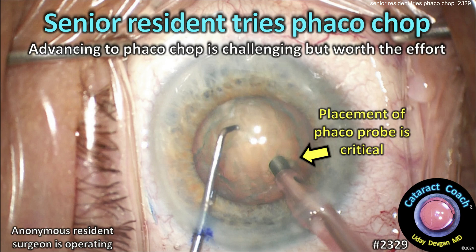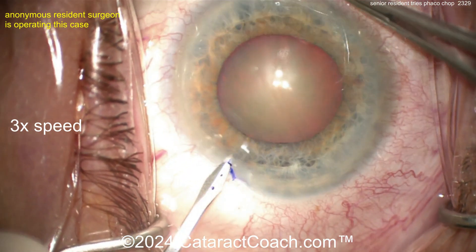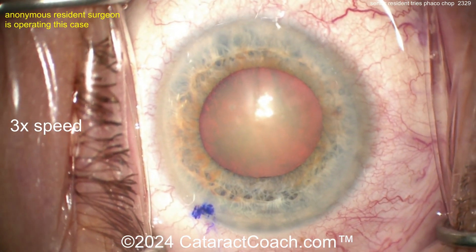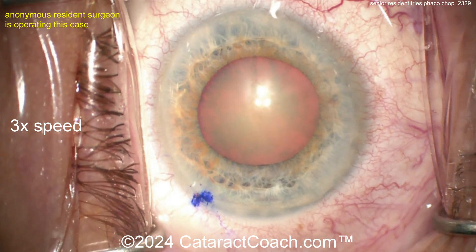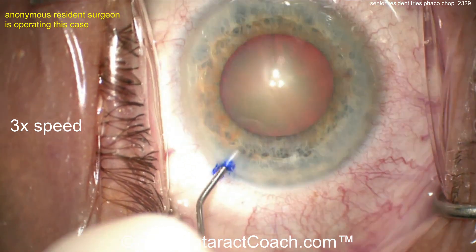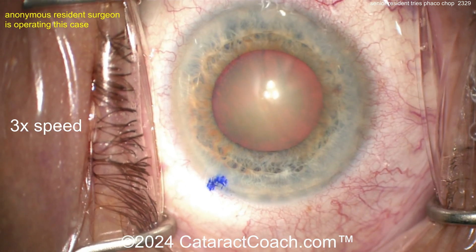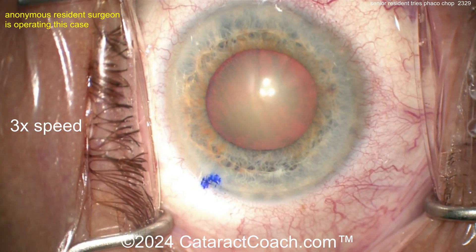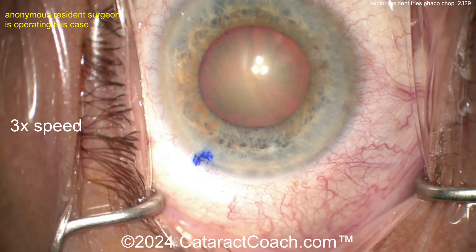CataractCoach.com — a senior resident tries faco chop. Advancing to faco chop is challenging but it's worth the effort. We're watching this anonymous resident at 3x normal speed. There's a little ink mark placed on the blade so you can find the paracentesis, because sometimes it's hard to find. Now going inside the eye — injecting some anesthetic, and good draping by the way, eye in primary position.